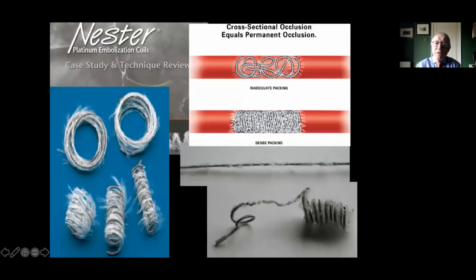How do we do embolization? Well, we put a catheter usually in a vein in your right groin, the femoral vein, and we thread it up through the veins in the right side of the heart into the lungs. And we use various different methods to block the blood flow into the pulmonary AVMs. Usually we use these coils.